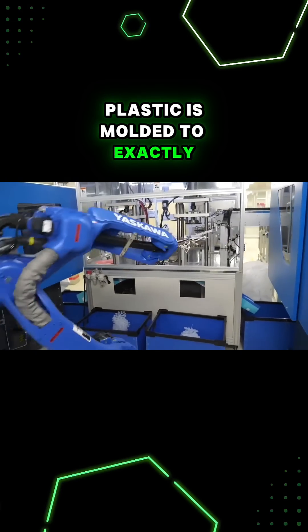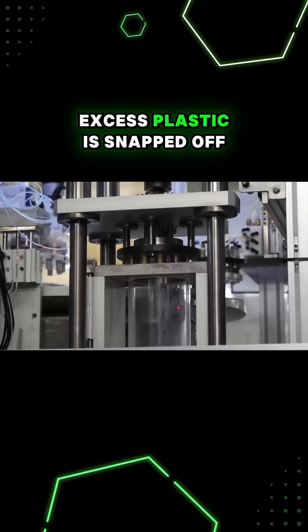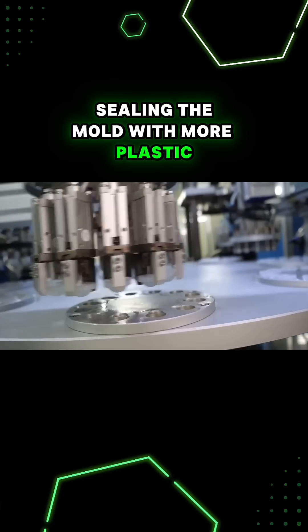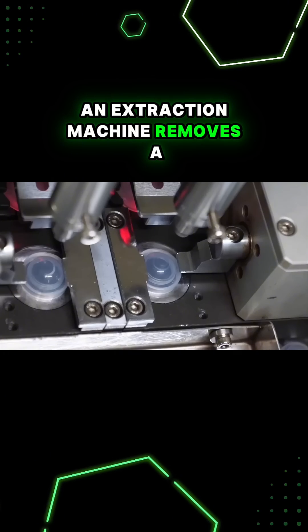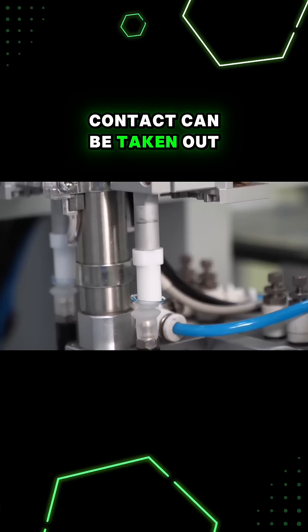Plastic is molded to exactly match the shape of the high precision cores. Excess plastic is snapped off, and then the lens material in liquid form is added. Sealing the mold with more plastic holds the hydrogel in the shape it needs to be. An extraction machine removes a layer of the plastic so that the actual hydrogel contact can be taken out.